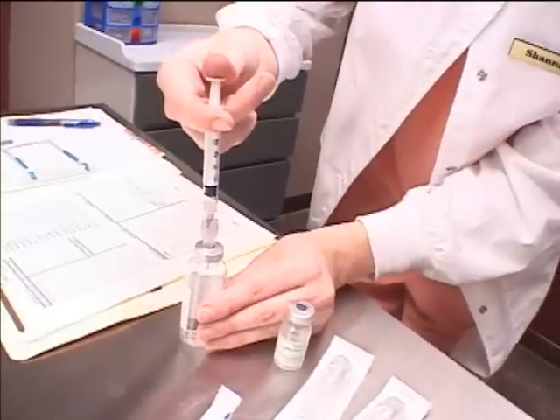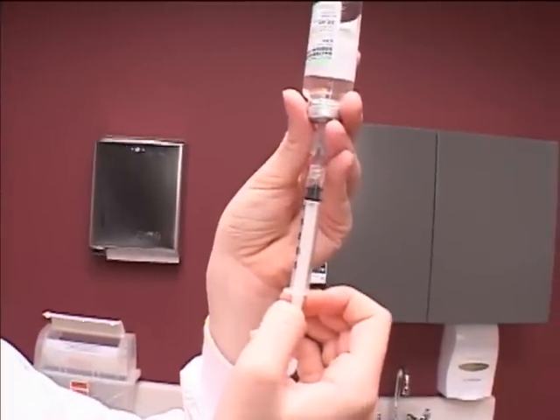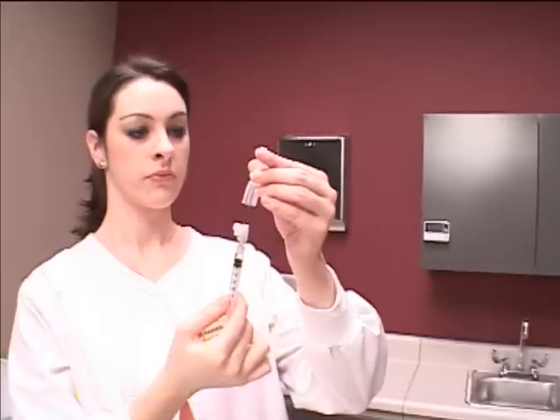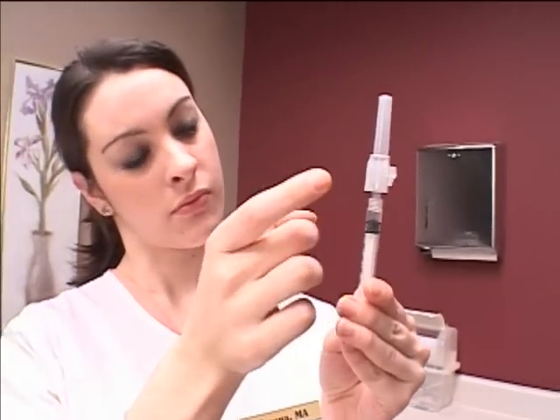Next, draw air into the syringe equal to the amount of medication to be drawn up from the first vial. Inject air into the first vial, then invert the vial. Gently pull back the plunger until you reach the desired amount. Remove the syringe and recap the needle according to institutional policy. Flick the needle to remove air bubbles.